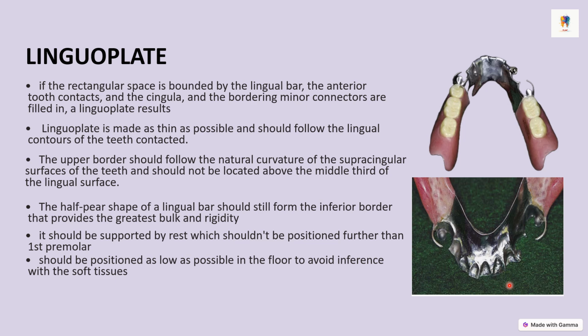patient talks. If the middle third of the lingual surface is crossed, it will be seen in the oral cavity when a patient is talking to someone, and it will not look aesthetically good. So that's why we don't cross the middle third of the lingual surface when making this kind of lingual plate.